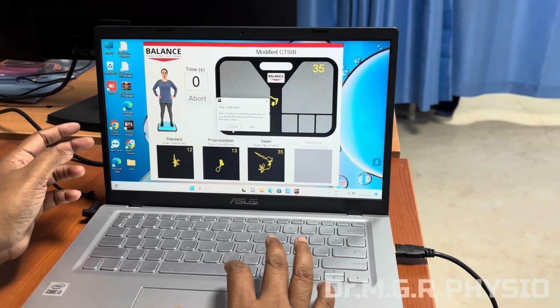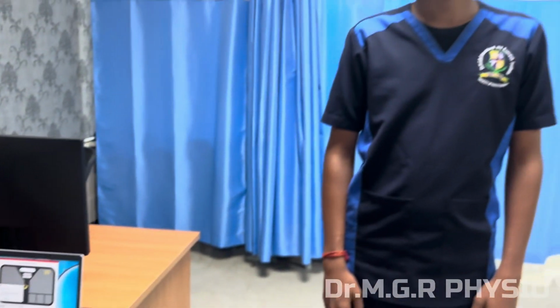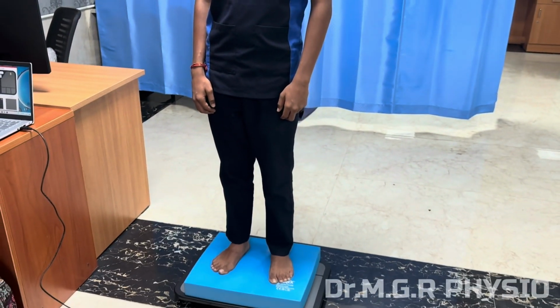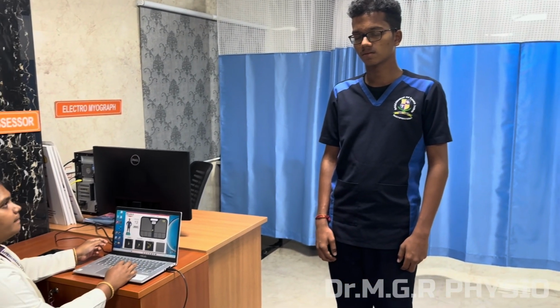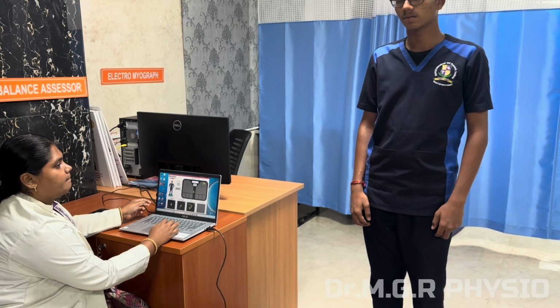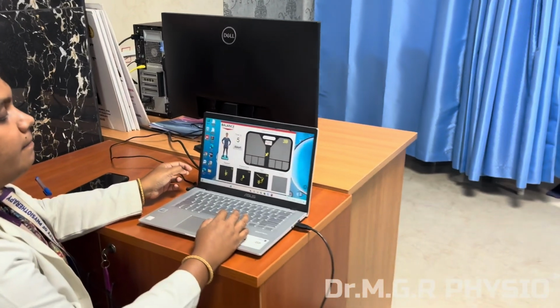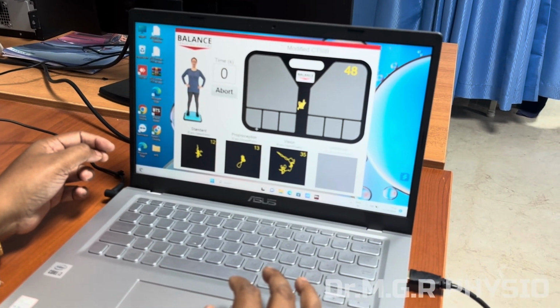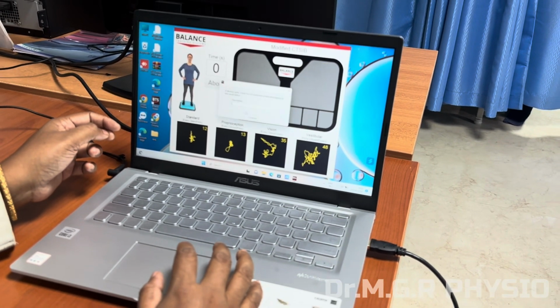Now we ask the patient to close the eyes. Close your eyes. Don't open until I say. Relax.